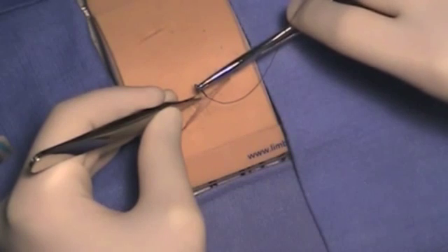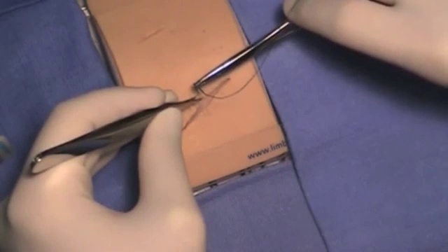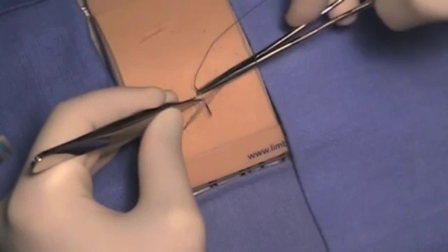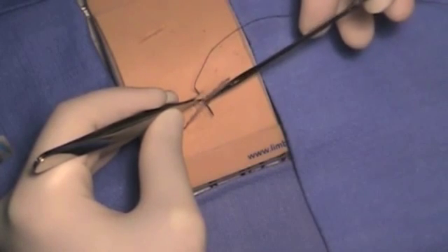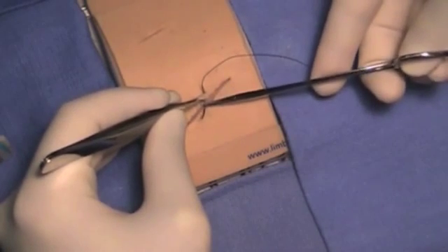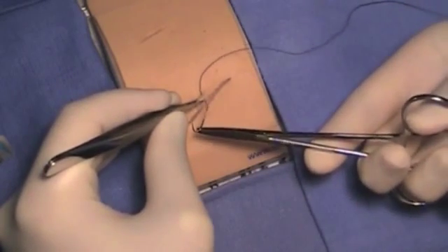The driving of the needle should be a twisting motion versus a pushing motion, as shown, until the needle driver touches the skin. The needle driver should then be released and reloaded. A twisting motion should continue until the needle is fully out of the skin.